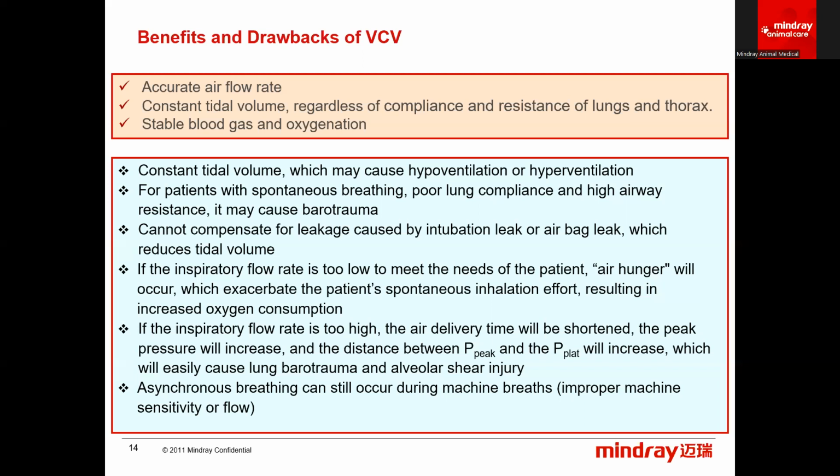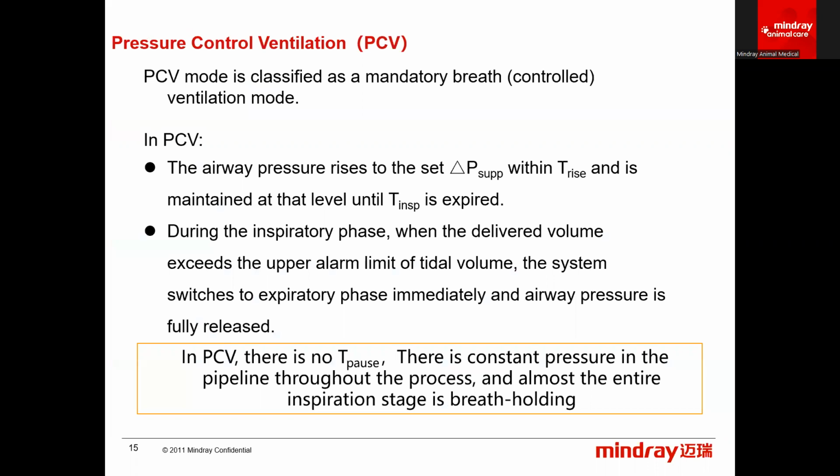And then again, you can end up with asynchronous breathing. So your patient can try to take a breath, and then the machine will go, oh, well, I'm still delivering this full tidal volume, whether or not your patient wants it. So you can end up with, again, lung damage there, lung injury there.